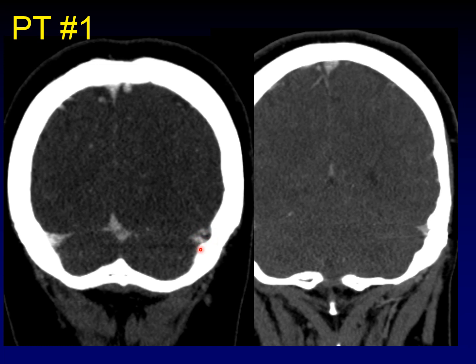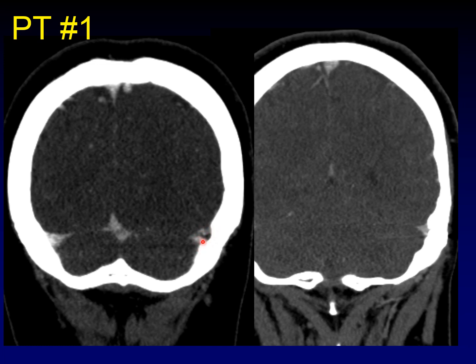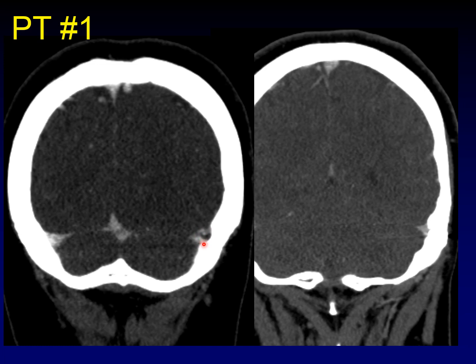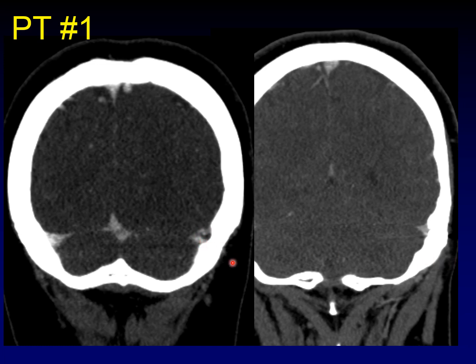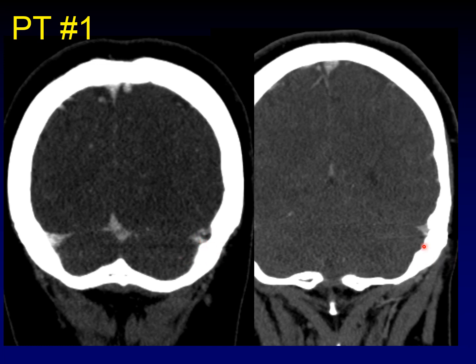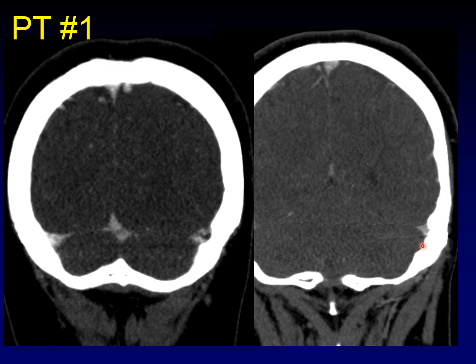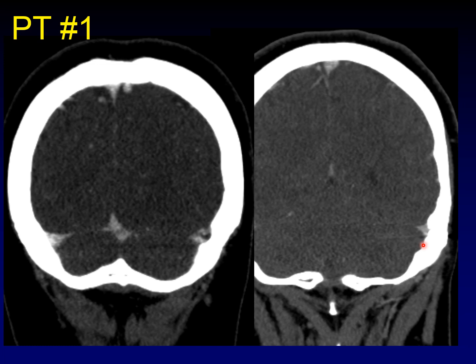There's an arachnoid granulation causing partial narrowing of the sigmoid sinus here. That's why there is such slow flow in this transverse sinus — too slow to be detected on MR venography. Well, that explains it. This patient isn't thrombosed, just a little narrowed.